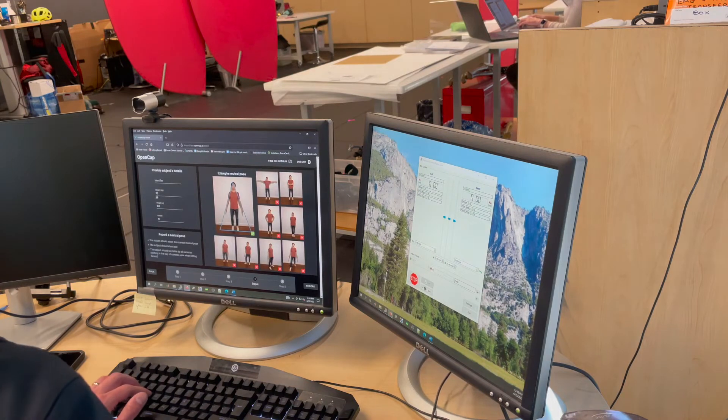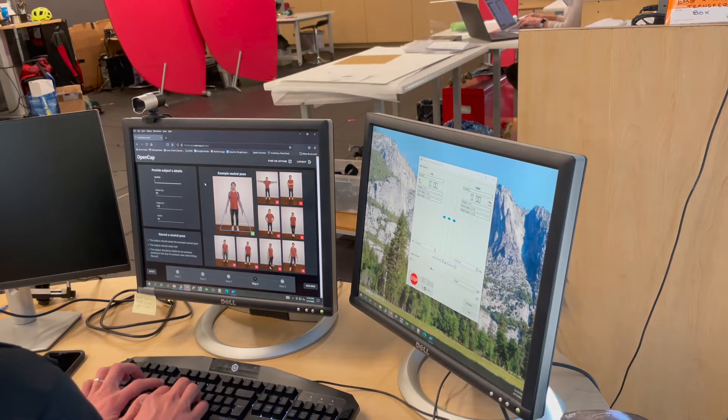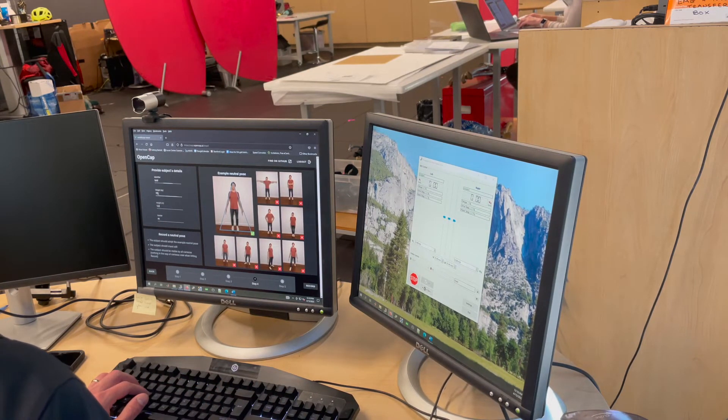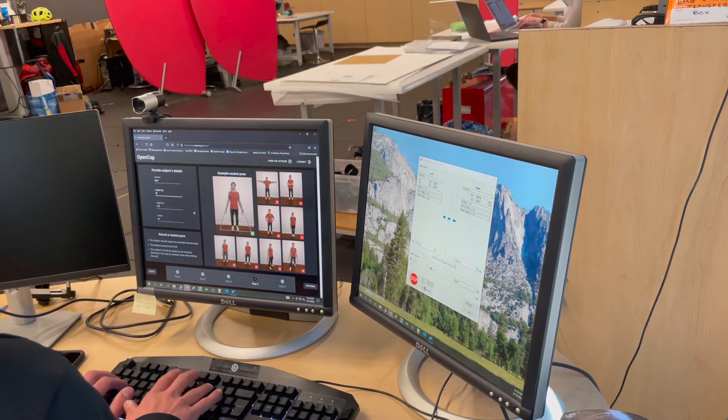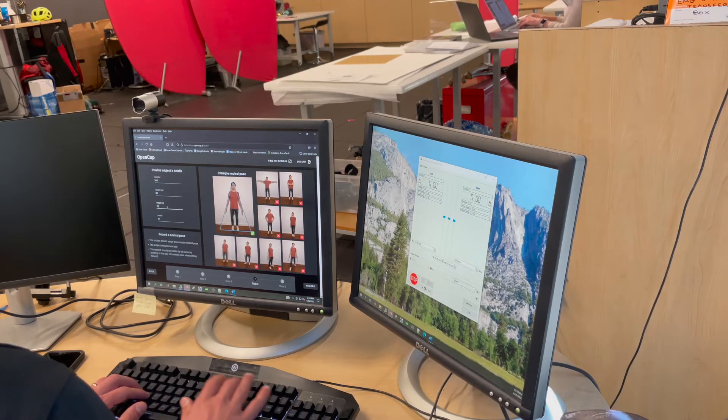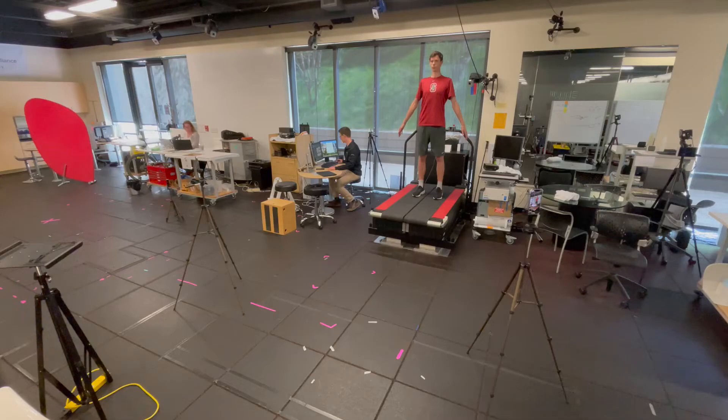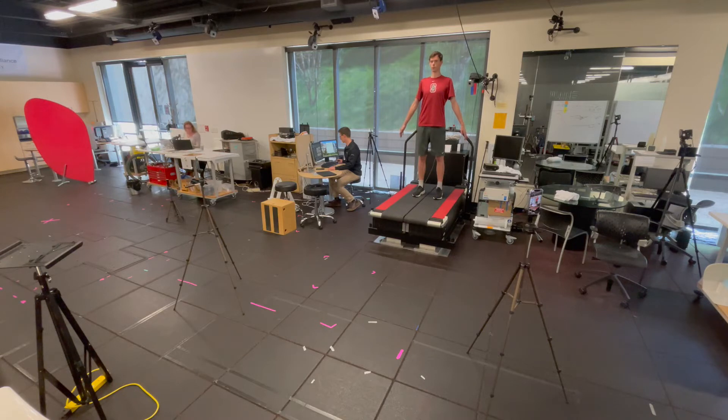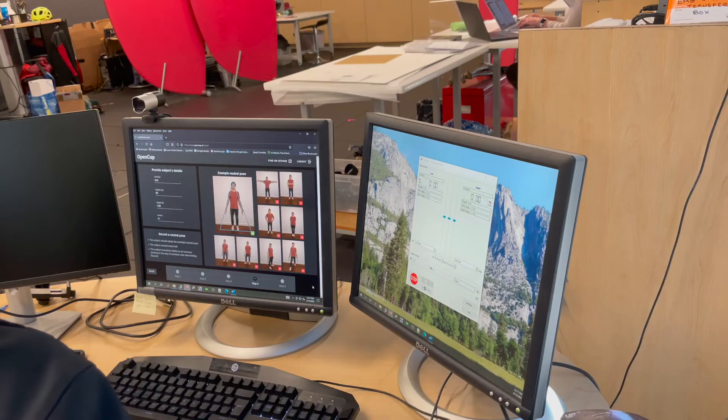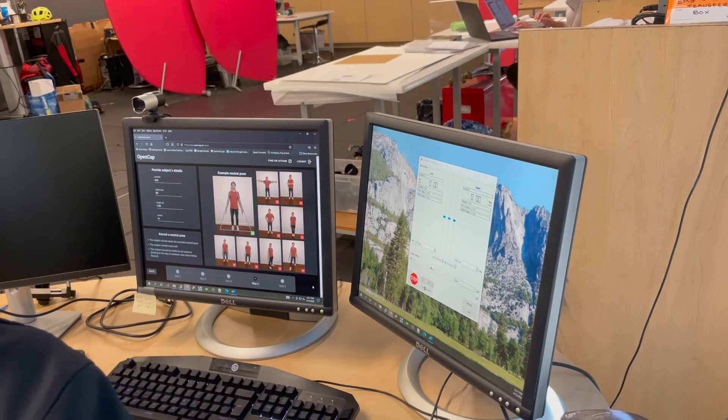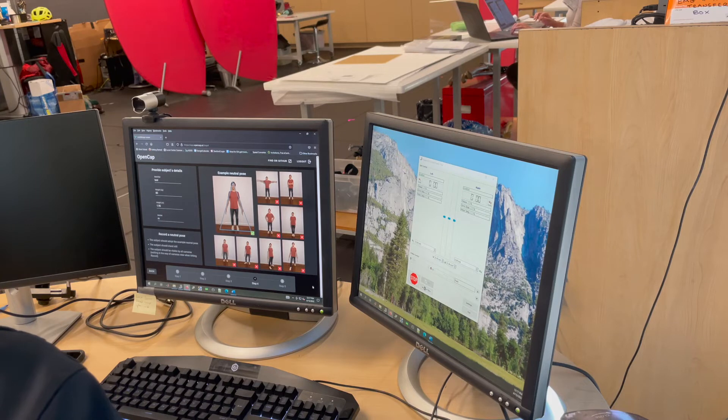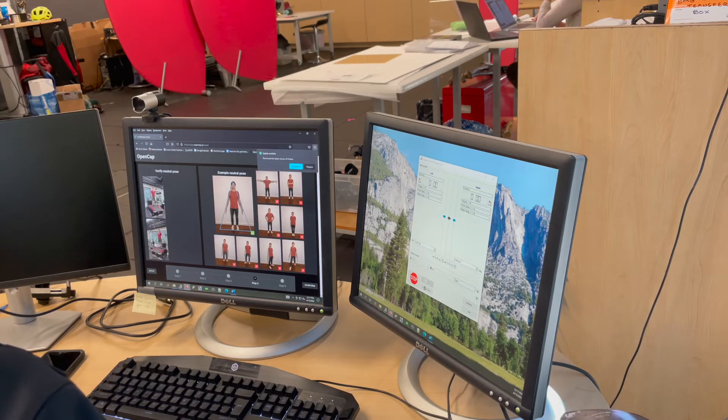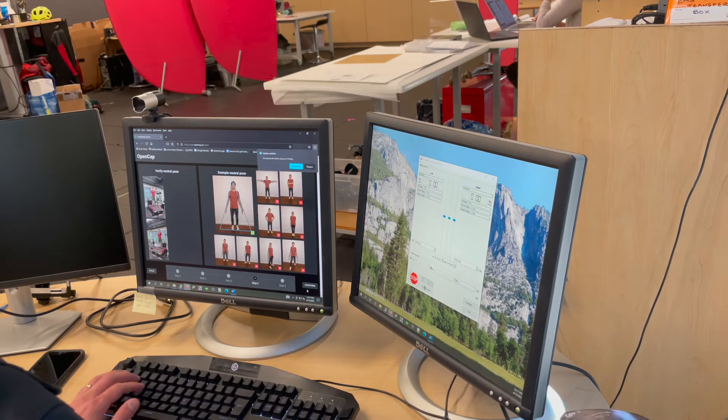Enter the participant identifier that is preferably not their name as well as their height and weight, and instruct the participant to stand in the neutral pose within the field of view of both cameras, with their toes pointed forward and their arms slightly out to the side. Click record and OpenCap will record a two second video of them in this pose. You will be shown their images to confirm the field of view of the cameras and you can then move on to collect data.